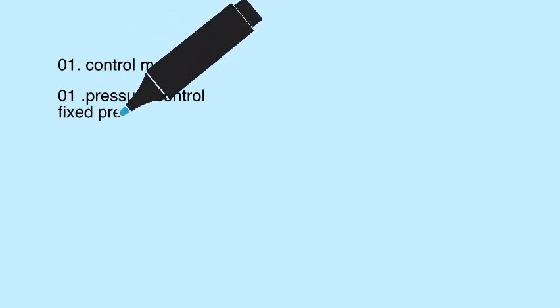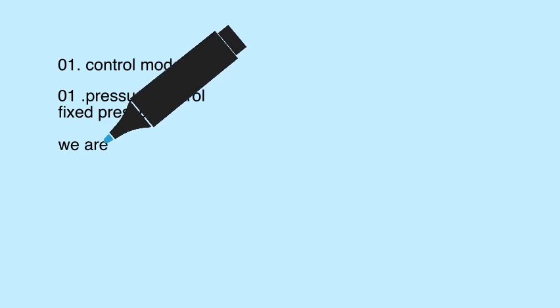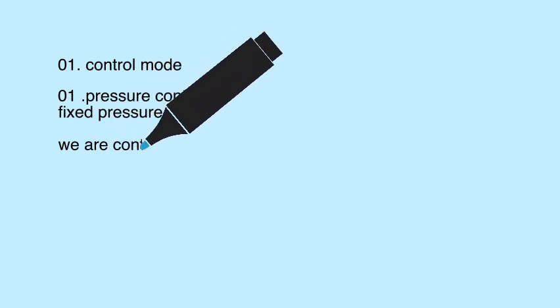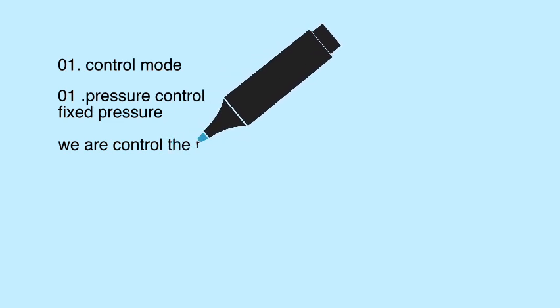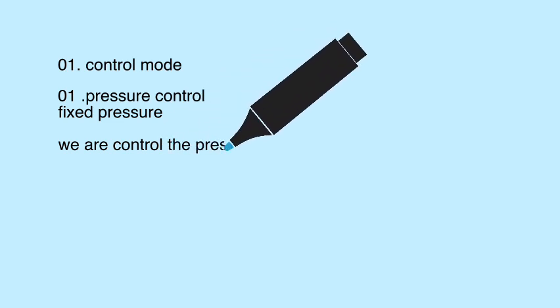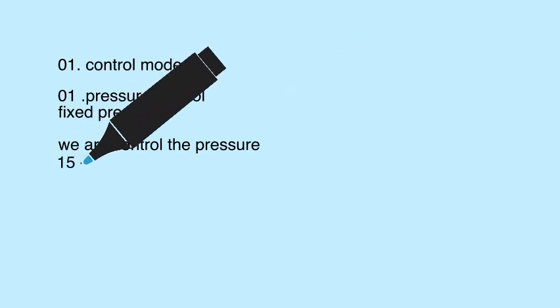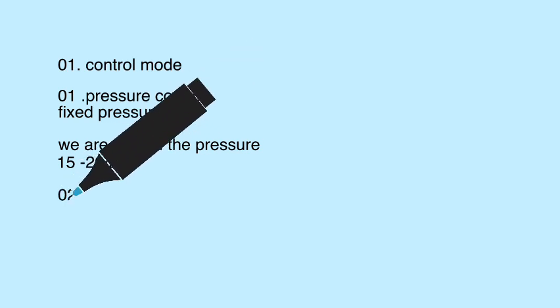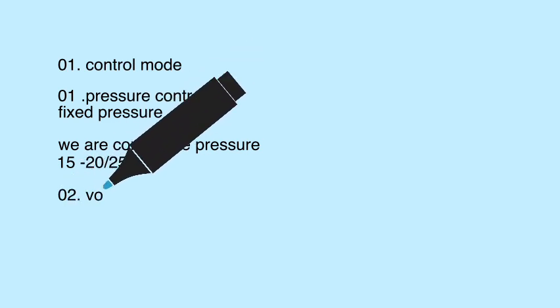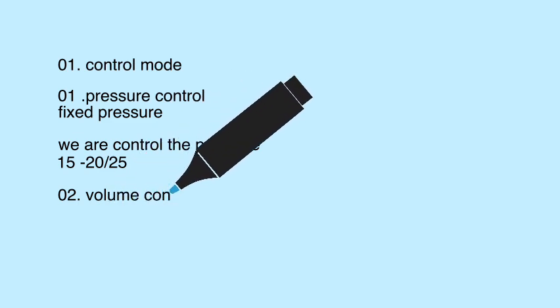Usually, just think that the patient is having severe bronchospasm. Anyway, the airway pressure will be high, but the machine is not going to exceed the pressure while providing the volume. So in those sorts of conditions, pressure control will be good. The importance of pressure control mode is that it prevents barotrauma. Barotrauma is the trauma in the airway due to high pressures. So pressure control mode is very important to prevent barotrauma occurring in the patient's airway.